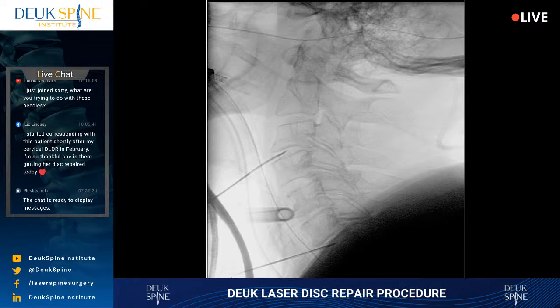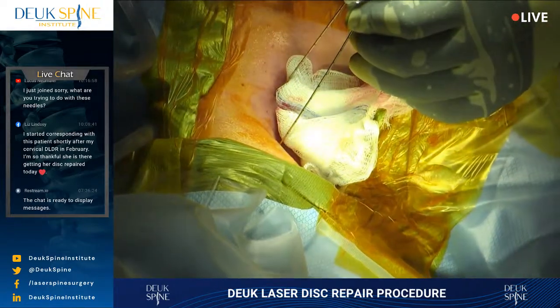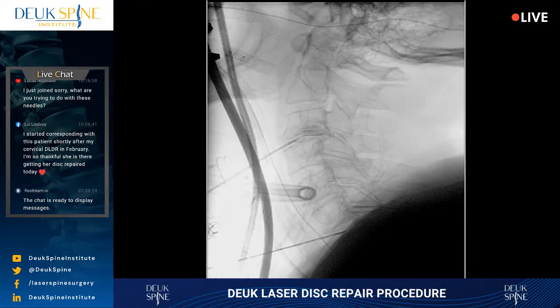And then we're just going to let it sit until we get to it at the end. That will be the last disc we do. Shot. All right, there's our discogram. You can actually see the dye leaking out through the tear in the back. It's outlining the herniation at C3-4 at the back of the disc. All right, but that will give a shot.